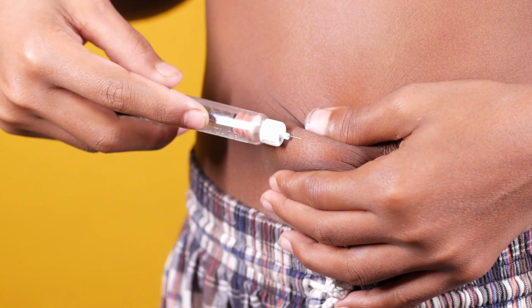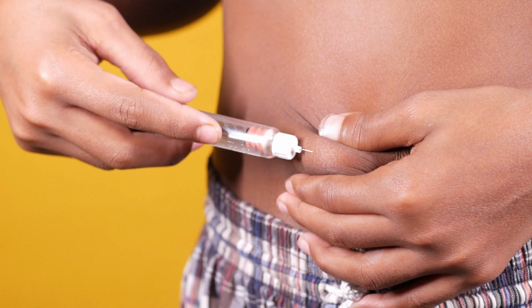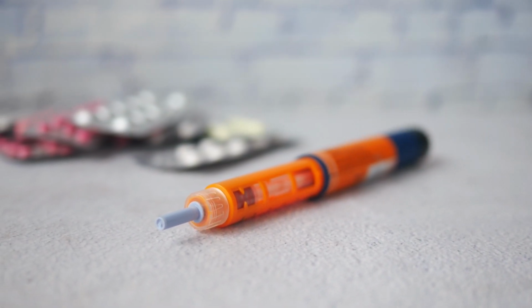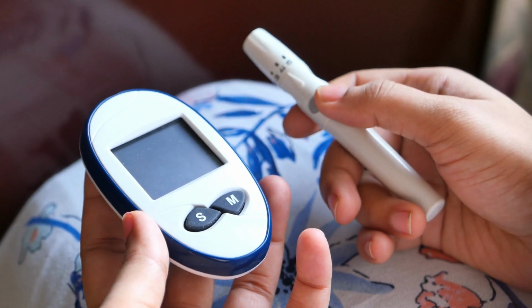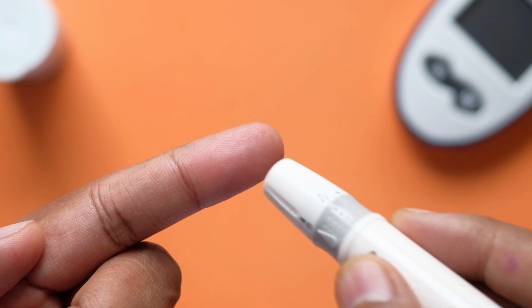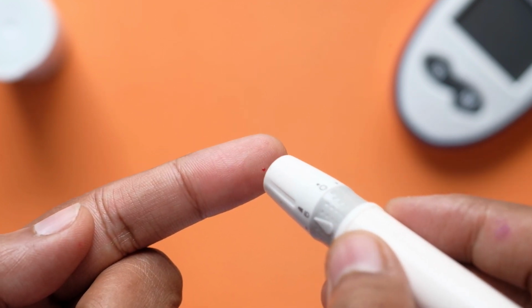If you have diabetes type 1 and you are on insulin, or type 2 diabetes and you require insulin or medication that lowers your blood sugar levels, it is more than likely that you are doing the finger prick test, also known as BM. Now, the finger prick test involves using a small needle called a lancet to draw blood from your finger to use on a test strip.